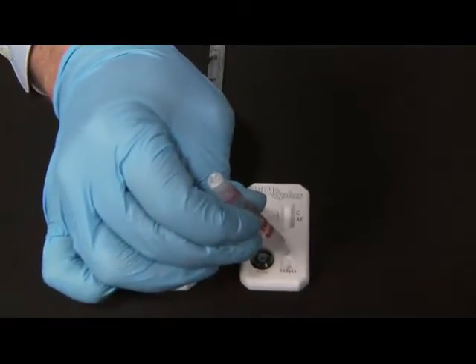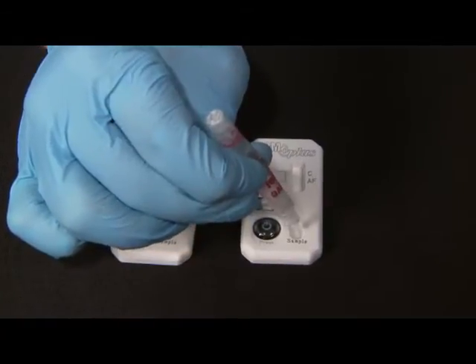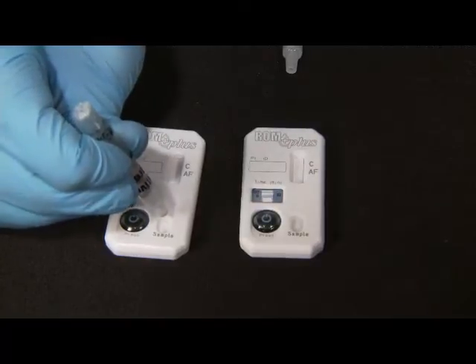Add four to six or more drops of the positive control solution to one ROM Plus test cassette. Add four to six or more drops of the negative control solution to the other ROM Plus test cassette.